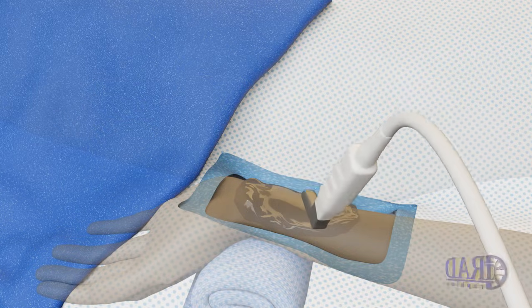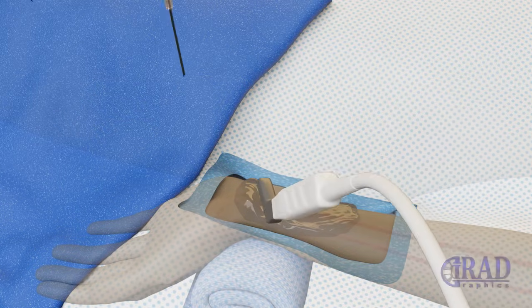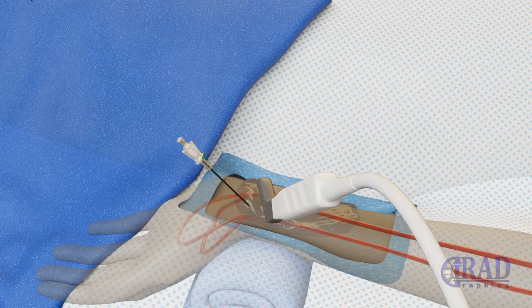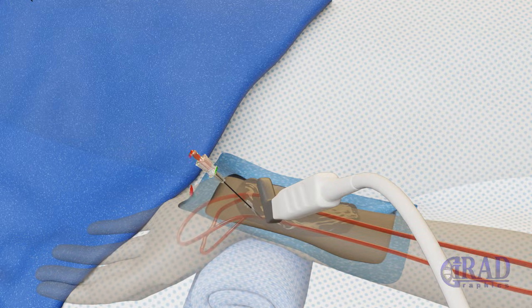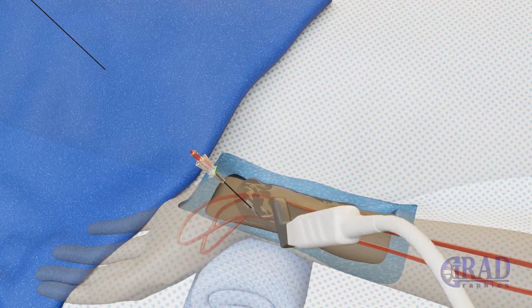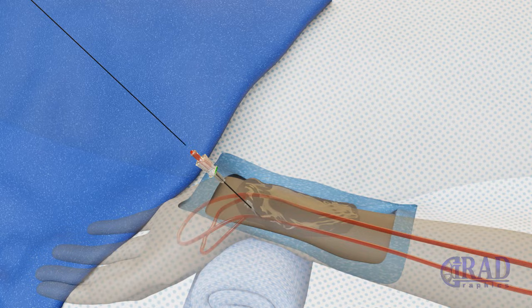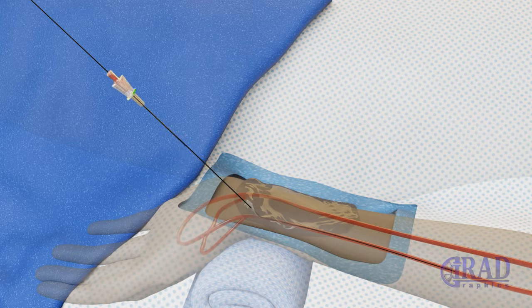As the first step, the left radial artery is accessed under ultrasound guidance using a micropuncture needle. Once blood return is noted, a microwire is advanced through the needle into the left radial artery. Then the needle is exchanged for a sheath.